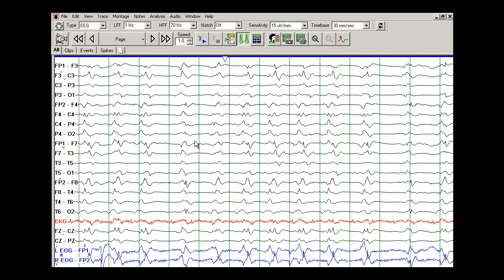What does this mean? So if you see an EEG which shows PLEDs or BIPLEDs or generalized periodic epileptiform discharges, what is the significance in determining the prognosis of the patients? So first of all, each person has to be taken individually.